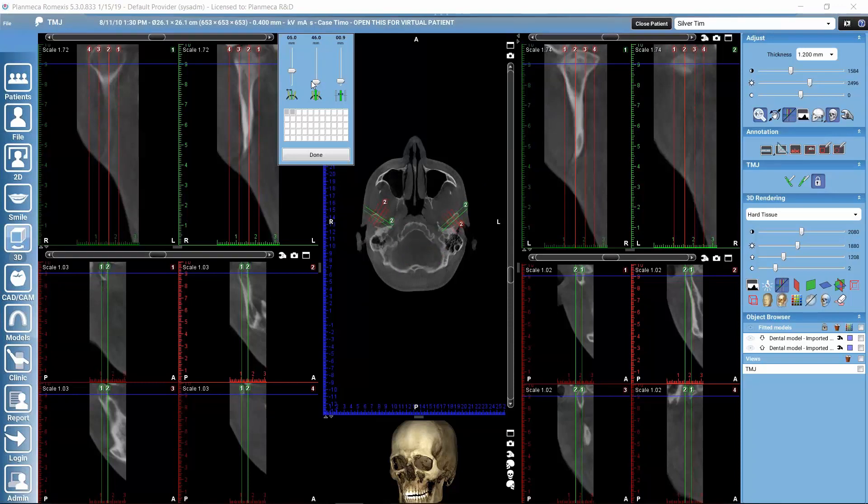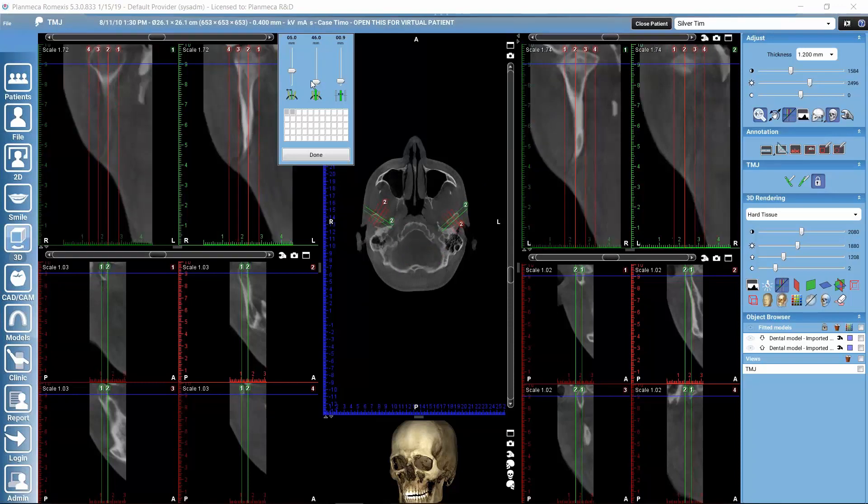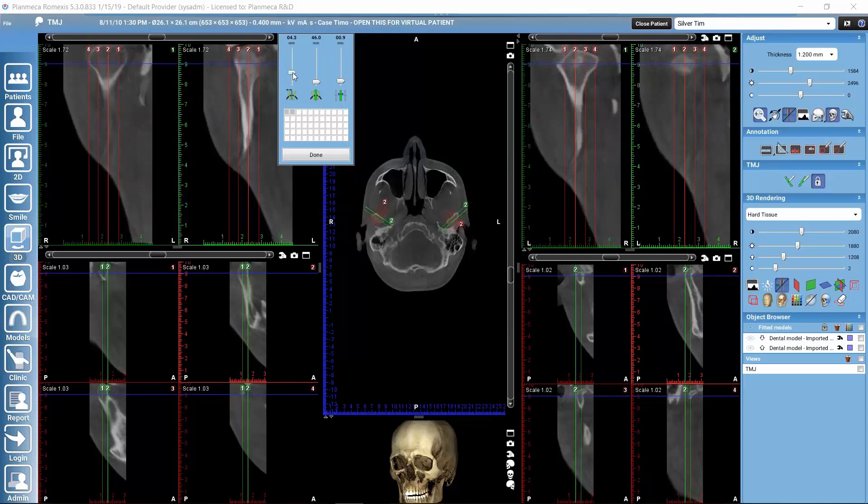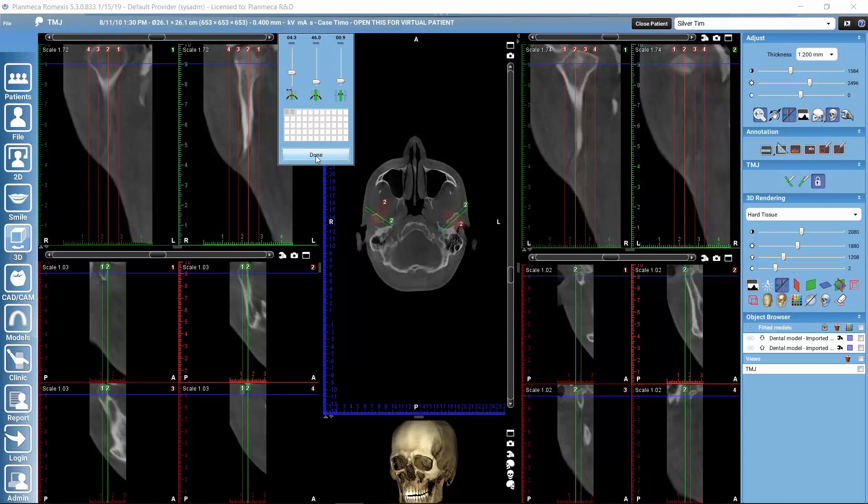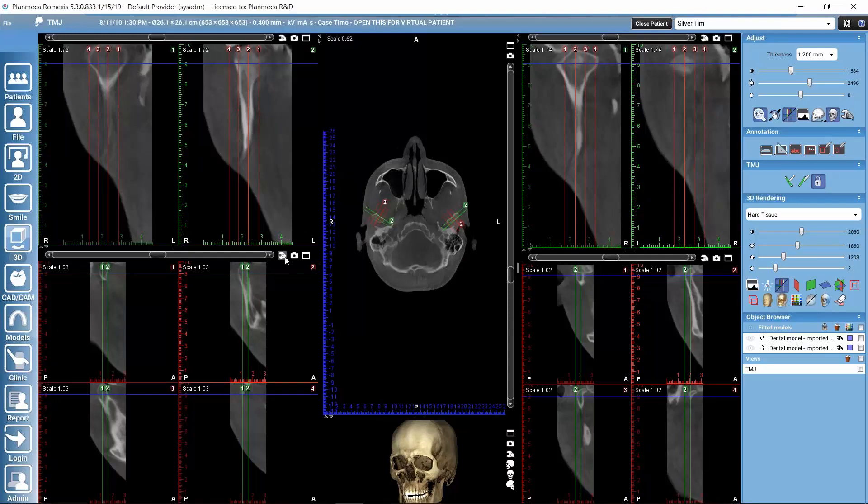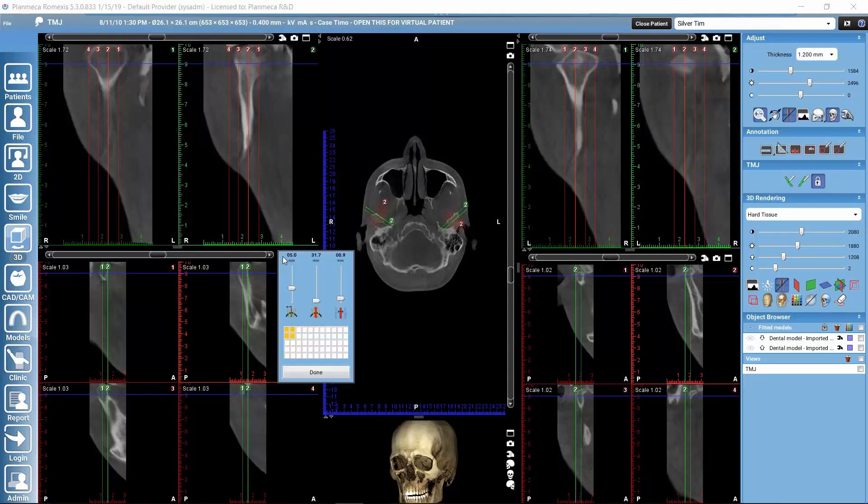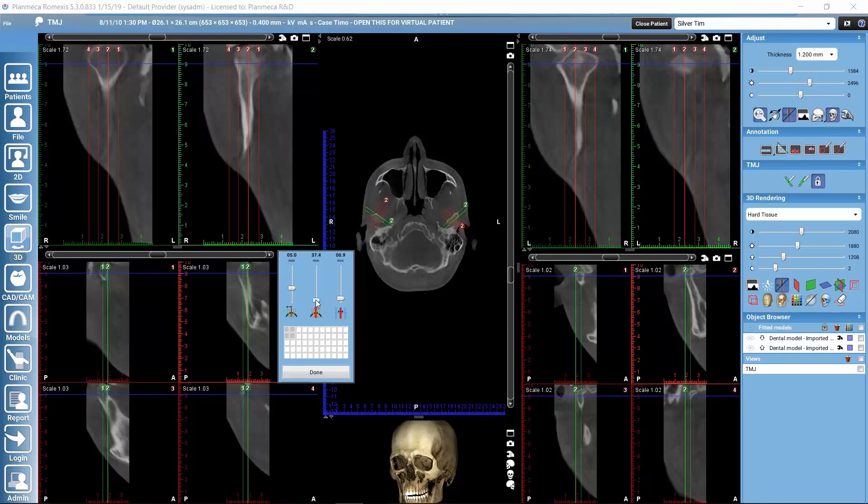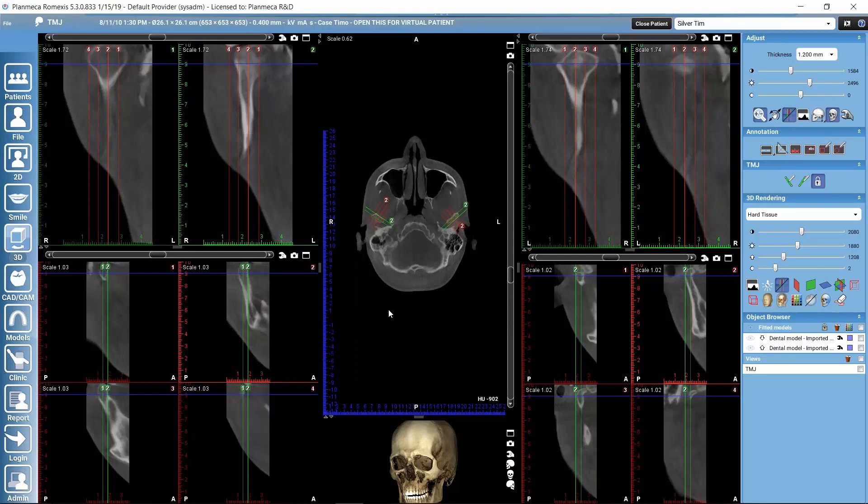We can use the slider here in the middle. Then we can determine what is the distance between the neighboring slices that are displayed here. And then we can adjust the thickness of each individual slice. That applies, of course, to other views as well. We could adjust also here the width and other things.